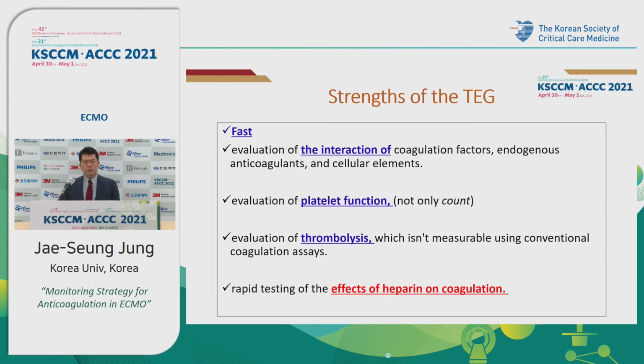The advantage of TEG testing is that it can be done very fast, and it can evaluate the interaction of coagulation factors, endogenous anticoagulants, and cellular elements.